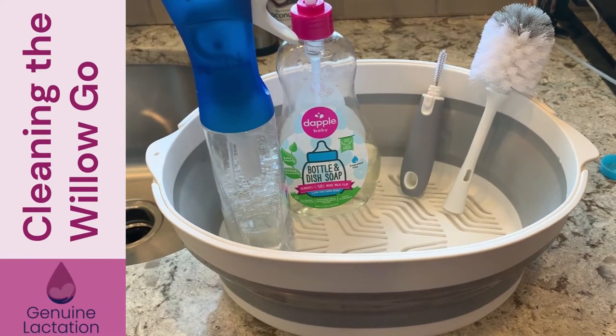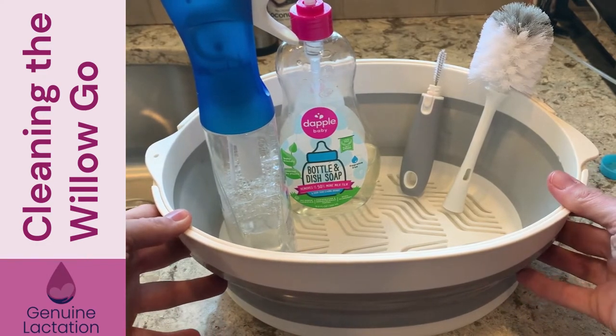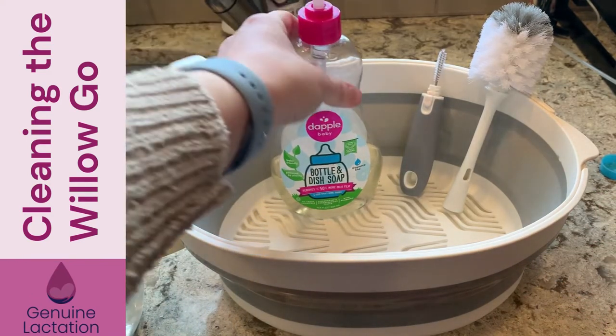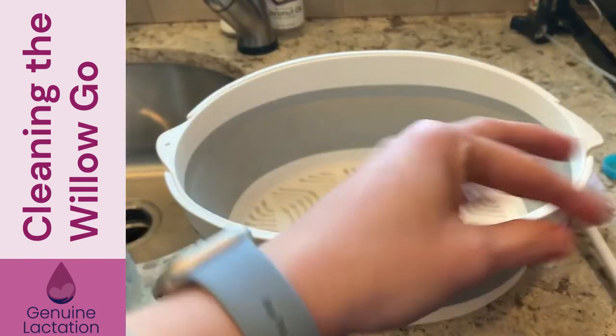I'm going to show you how to wash the Willow Go so that you can keep your pump in good order. The first thing you want to do is collect all your supplies. I've got a clean basin — we don't want to put our pump parts in the sink because of cross-contamination. I've got Dawn Power Wash, Dapple, and the regular scrub brush and the detail brush.